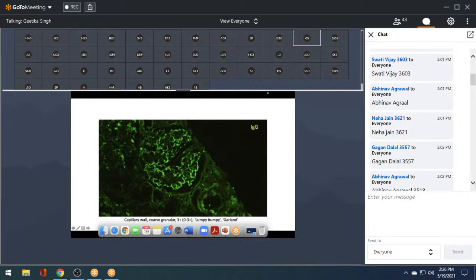What we look for is the appearance of a Bowman's capsule. Now within this glomerulus, I can make out that the deposition is mostly at the periphery, if you can see my arrow there. And now I know what my glomerulus should be looking like. So I will assume that this is my mesangium, right? Because the mesangium is the stalk which is in the middle.